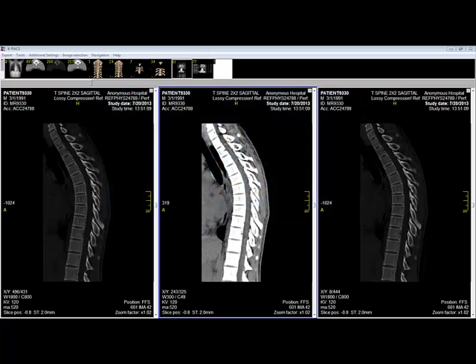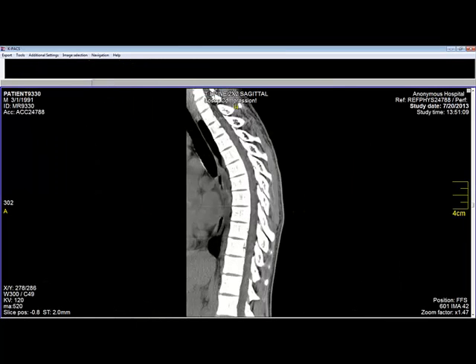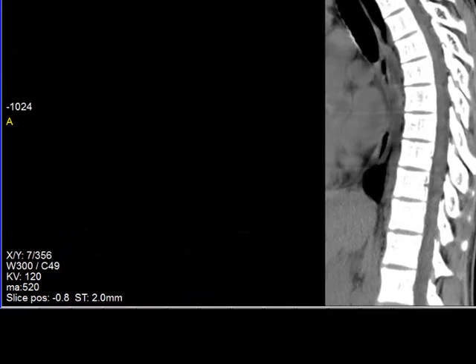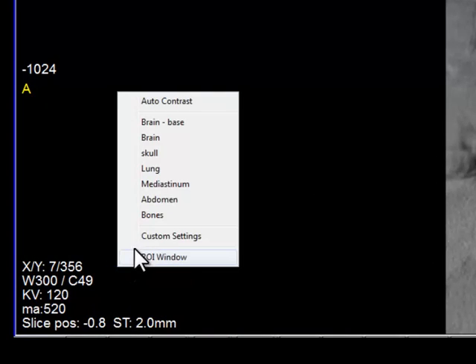Let us focus on the center tile screen whose windowing is set to mediastinum. Notice that the windowing width and center are displayed in the lower left-hand corner. The width is 300 and the center is 49. Now let us adjust the windowing to optimize the viewing of bones.